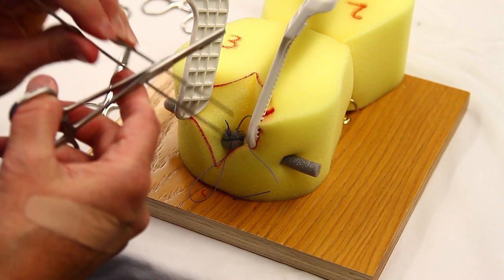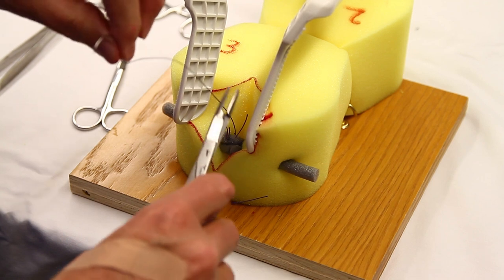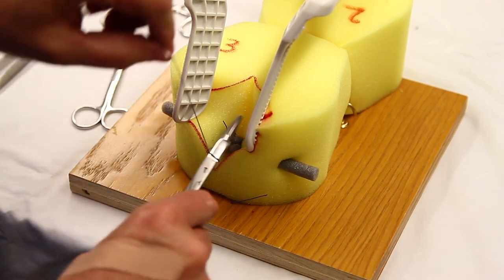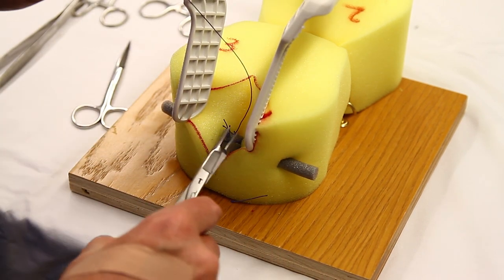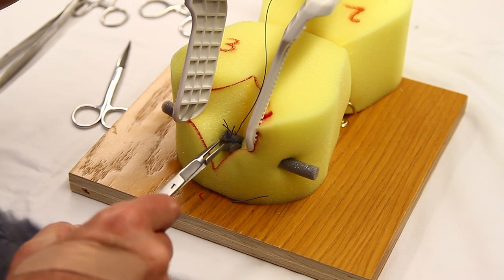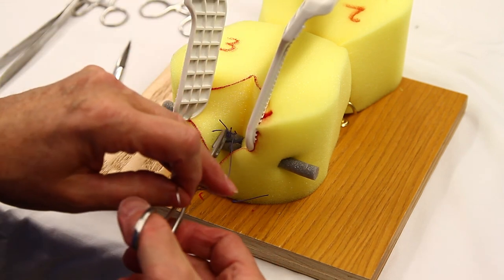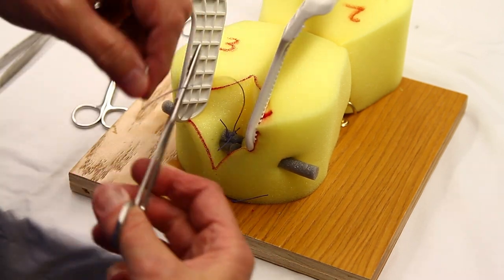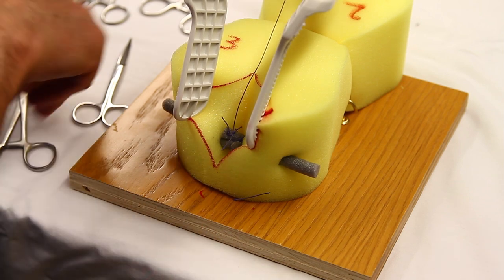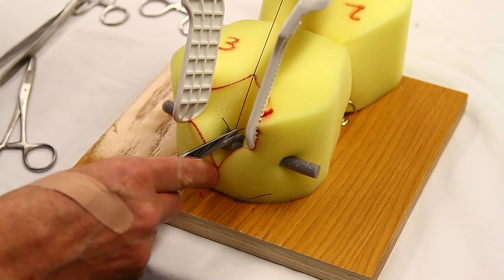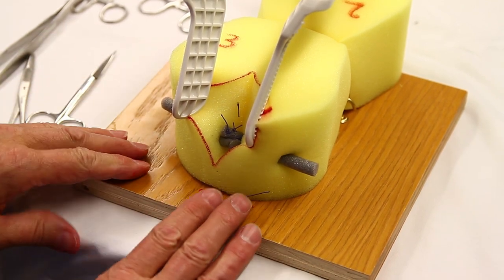Remember to include the fascia around this rectal muscle. That's the heart, that's the strong part of the repair. And don't crush it, just approximate it. And then we'll cut that short about a half a centimeter to a centimeter long. And that completes the repair of the external rectal sphincter.